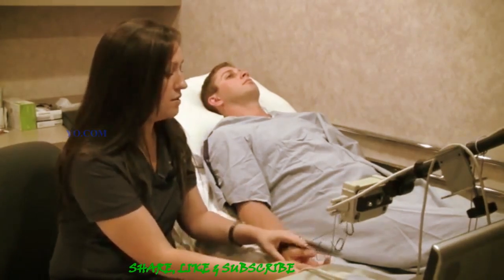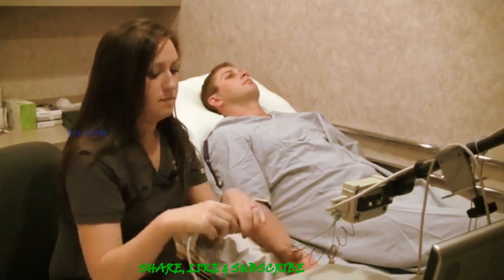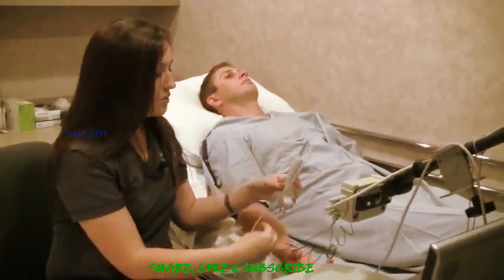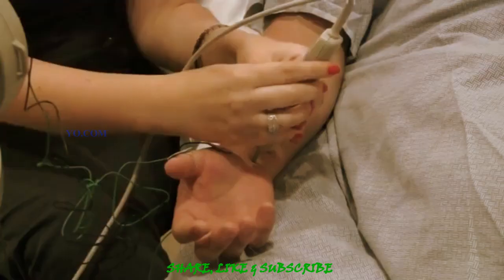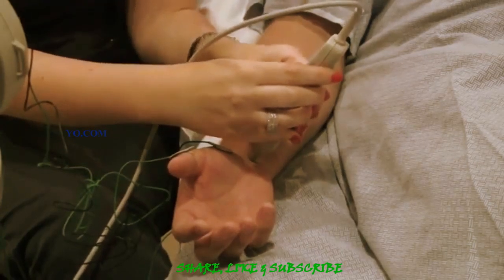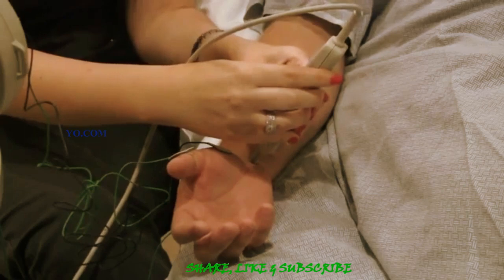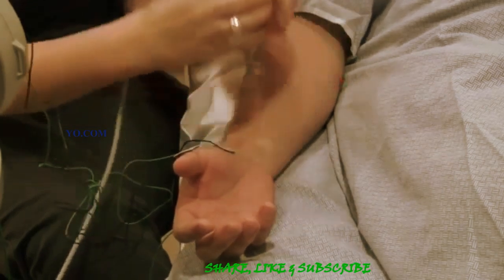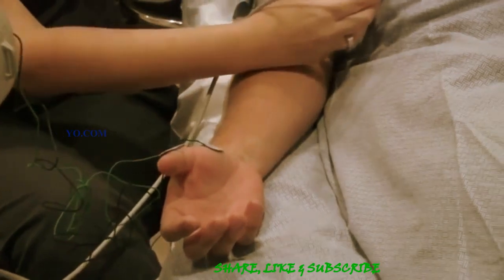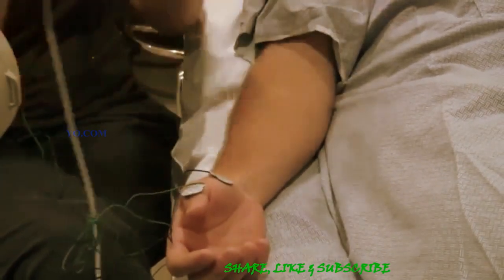Okay, relax your hand. Next, we take this instrument and stim several places on this nerve. We start out low and work our way up so that you're able to get used to the feeling. We'll do several places on your arm. Sometimes it can be a little uncomfortable, but it's very fast, so tolerable.